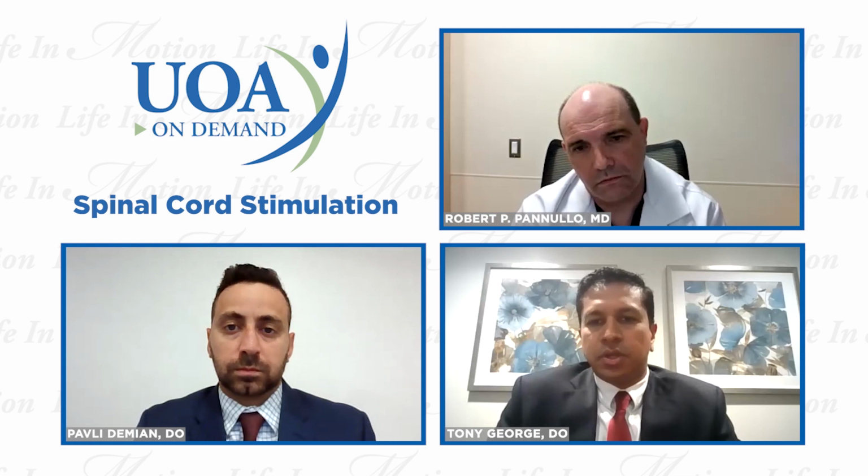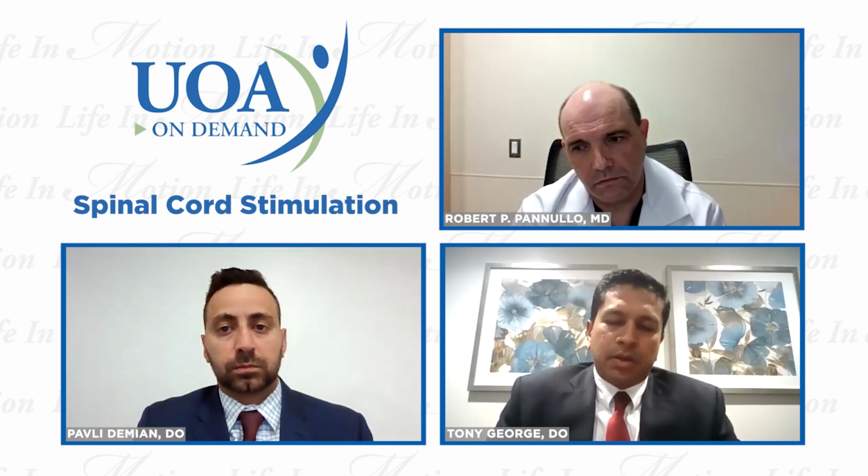Prior to scheduling the stim trial, there are a few other things we have to do. We have to also get a psych clearance. That is to ensure that we are truly selecting the right patient for this procedure, a patient that does not have any other psychiatric comorbidities, because they may skew the outcome of the trial. So we want to make sure that the patient truly has pain that is going into their limb. And we also get blood work and a chest X-ray, and we want to make sure that the patient, when we have selected them, doesn't have any bleeding disorders or any other reasons why they may not be a good candidate for this procedure. So those are some of the preliminary steps that I do before I schedule my patient for a spinal cord stim trial.